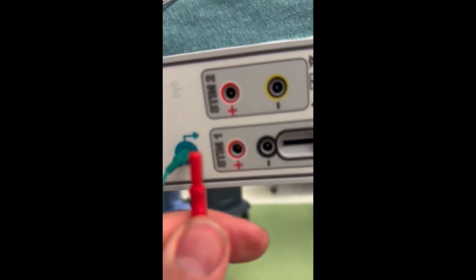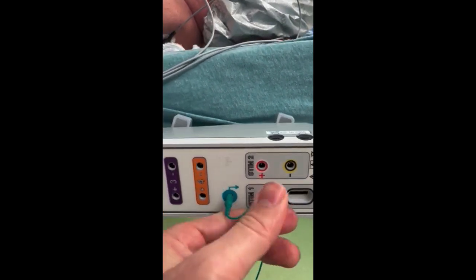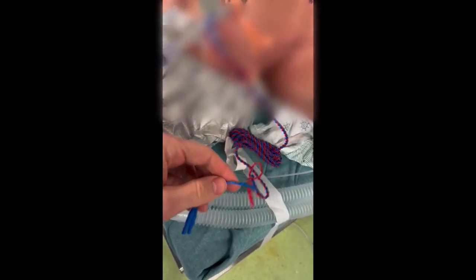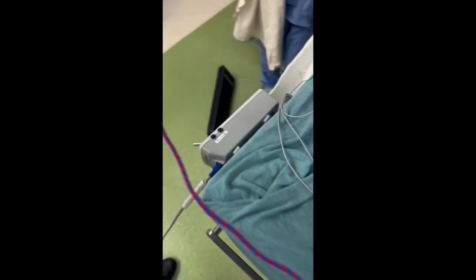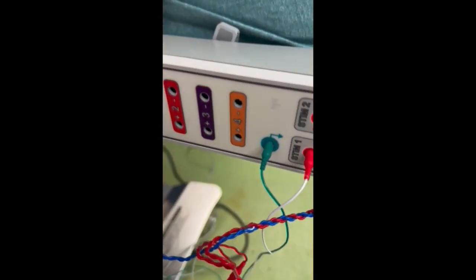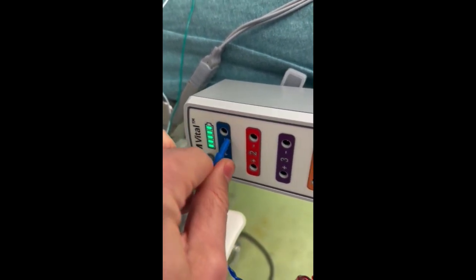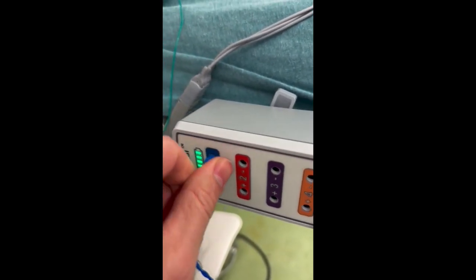The other end of these leads are plugged into the patient console. They're usually color-coded — the green ground goes into the green slot and the red for stimulator one goes into the red slot. For the endotracheal tube leads, those are also plugged in blue to blue, red to red. Make sure you push these leads in firmly.